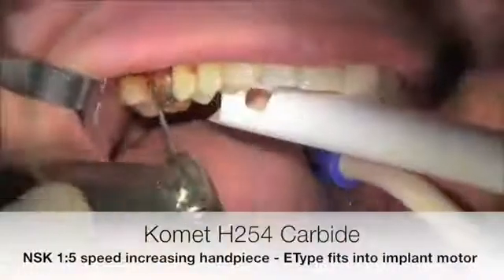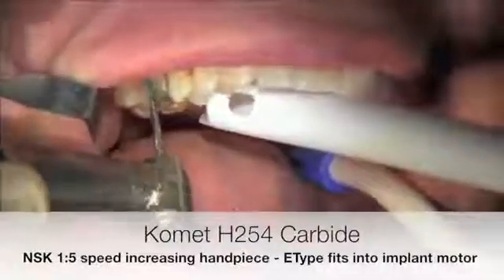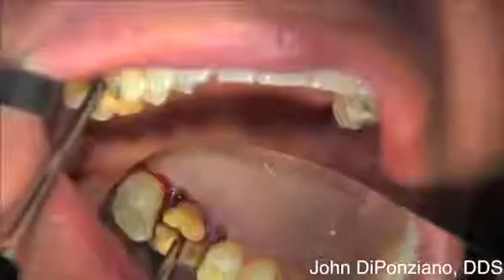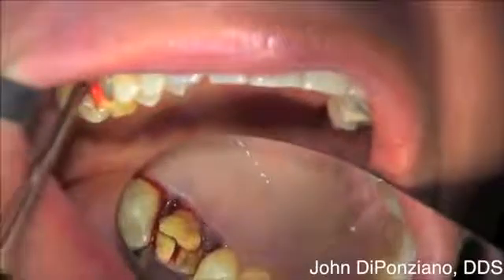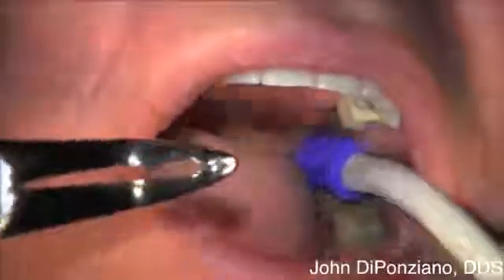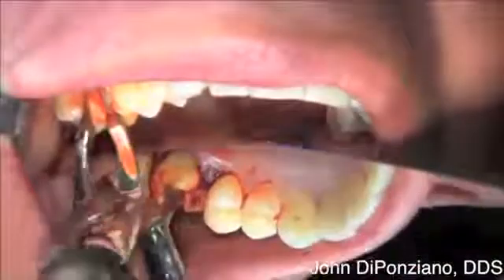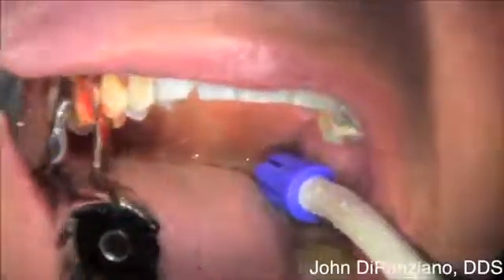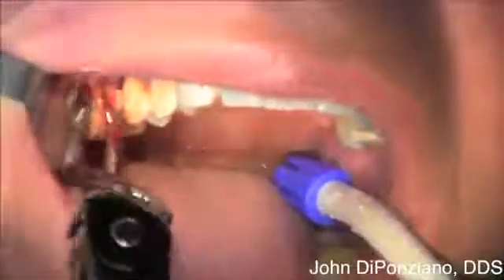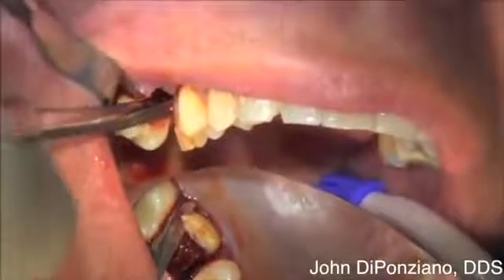This is a Comet H254 carbide in an NSK 1-5 speed increasing handpiece. It fits on an implant motor and uses sterile saline. No air comes out of that handpiece, so it's used for extractions. We elevate the roots after they're separated and remove them with a straight beaked forcep, being very careful not to disturb the facial plate.